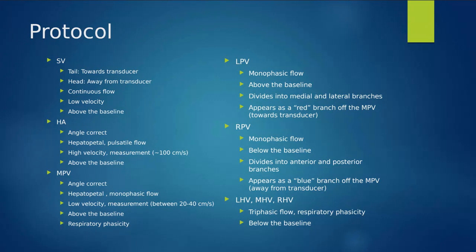There is a sort of rhythmic pattern to them as well, and that is because of their close proximity to the heart. As we know, they drain directly into that IVC. That IVC goes right into the heart. Look at our picture on the left side. Look how close our heart is located to those hepatic veins. They are going to pick up on those contractions of the heart, of the lub-dub of the heart, but it's still a negative Doppler shift, still below the baseline, still a venous waveform. So we're not seeing that true triphasic arterial waveform.